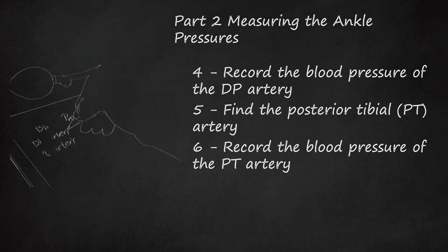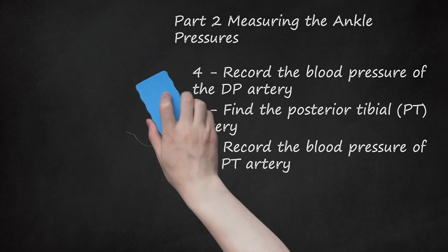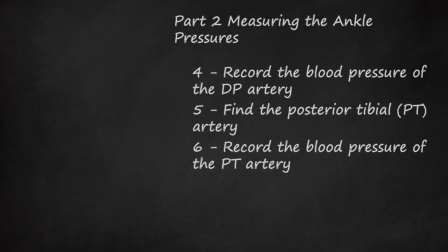6. Record the blood pressure of the PT artery. Repeat the same process that you did to find the DP artery. Once finished, record the pressure and then switch the cuff to the right leg. Record the blood pressure of the dorsalis pedis and posterior tibial arteries on the right leg.